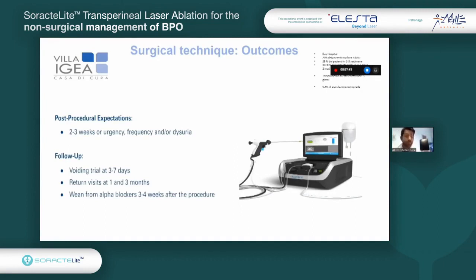As a follow-up, we used to do a voiding trial between the 3rd and 7th day, with a median of 5. We go for 5 days actually, and then a visit at 1 and 3 months. You can wean from the alpha blocker, so we discharge all the patients with an alpha blocker and glucocorticoid. We saw that 20% of patients get better immediately, 25% in 2 or 3 weeks, and 30 to 40% in 1 or 2 months.